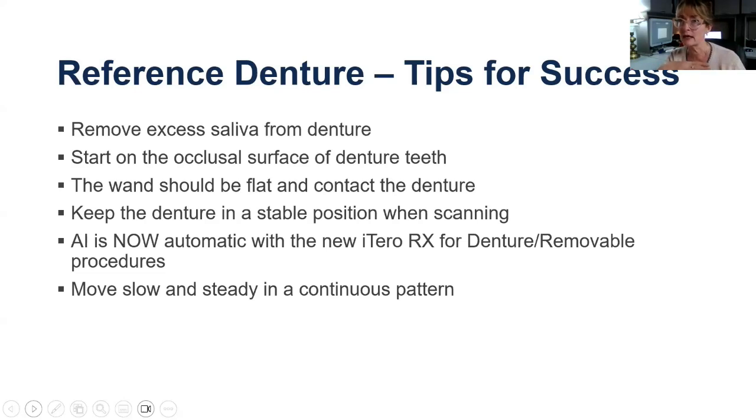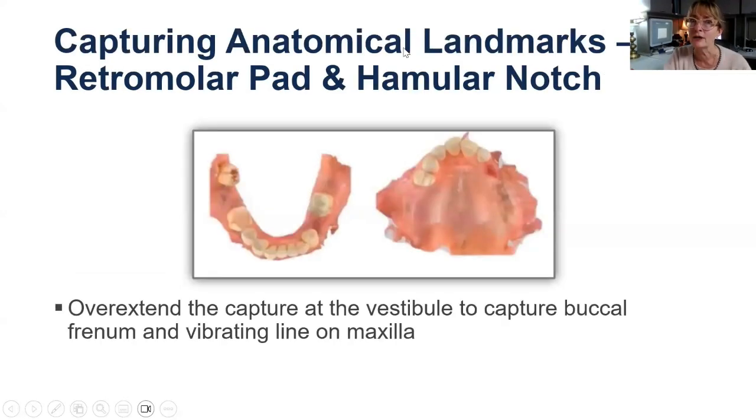Sometimes when you're scanning the maxilla intraorally, all that pink gingival tissue starts to look very similar, especially if the patient has been wearing a denture for a good amount of time. Their rugae usually isn't really present, with lumps and bumps and grooves, and it can be difficult to follow a pattern. So that's why I like to use the little Dr. Thompson sticks. Patients that have had recent extractions, oh my gosh, they're like the easiest people to scan because they have all the lumps and bumps and grooves that the scanners all pick up very, very quickly and very accurately.